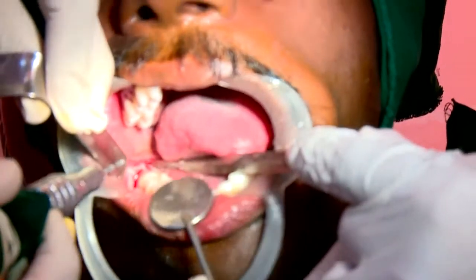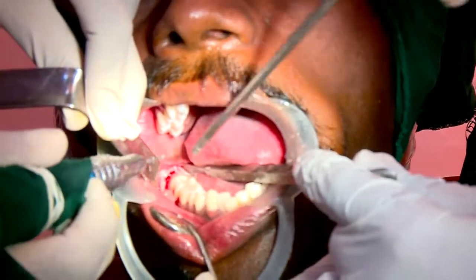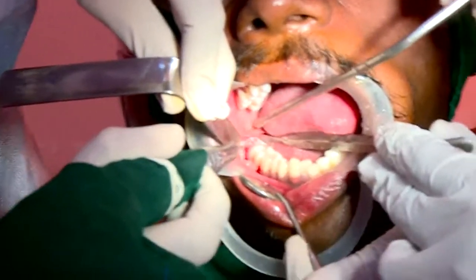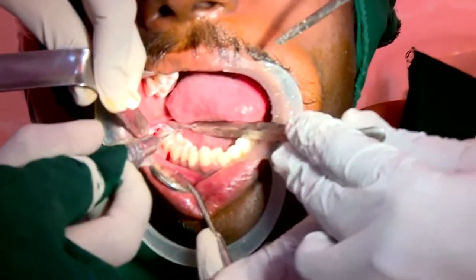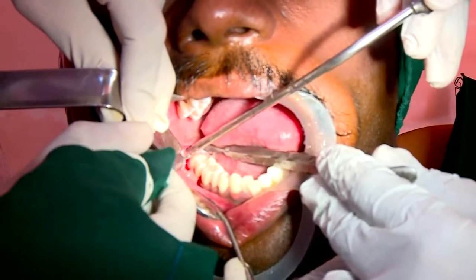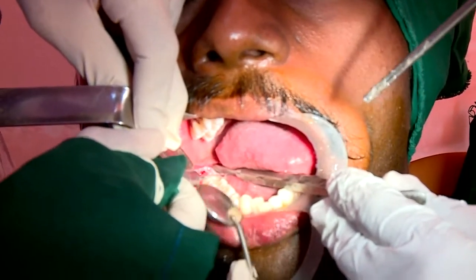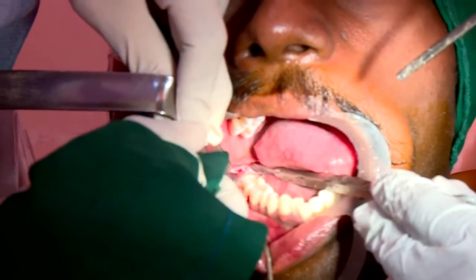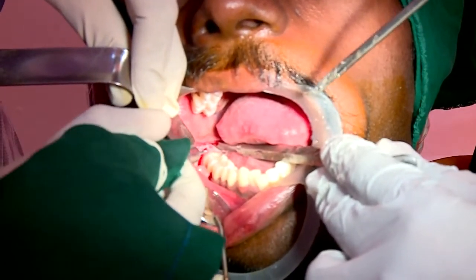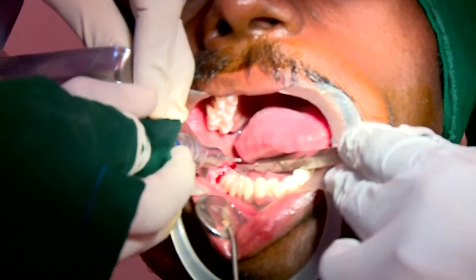So since the adequate amount of bone has been removed, the next procedure will be the sectioning of the crown. Sectioning of the crown for a horizontal tooth is mostly based on the crown and root ratio. That is, make a vertical cut on the collar of the crown, so that you can split the crown and remove it, creating enough space. We can then push the roots into the space and elevate them. That's the principle behind it.